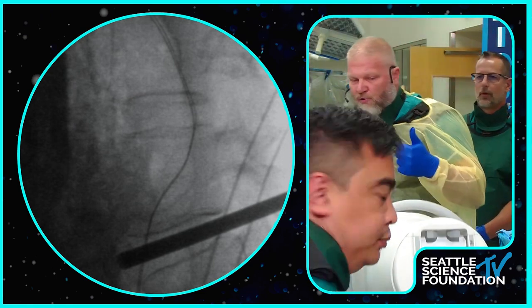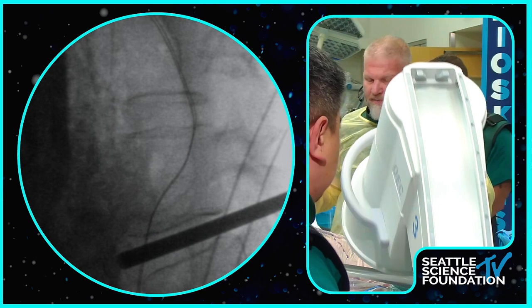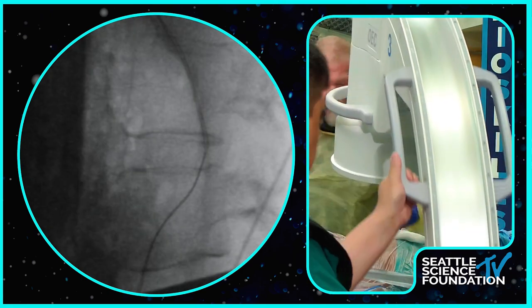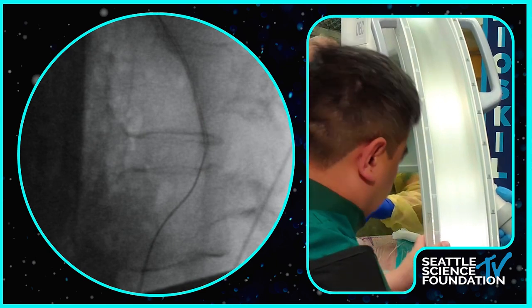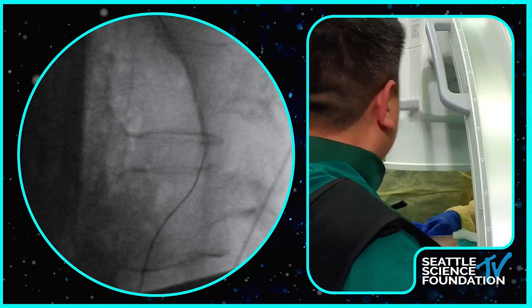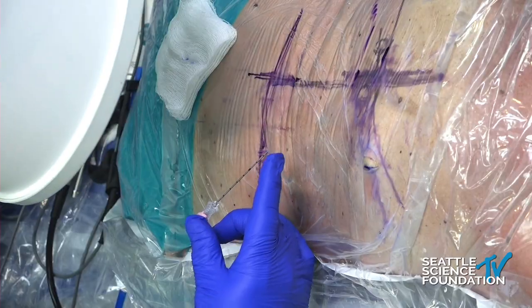Again, normally at my starting point, I would use the MRI to plan out the trajectory. Since we don't have that, you do a little Kentucky windage here. So, 18 gauge needle, I'm going to put this in and go down to my disc space.